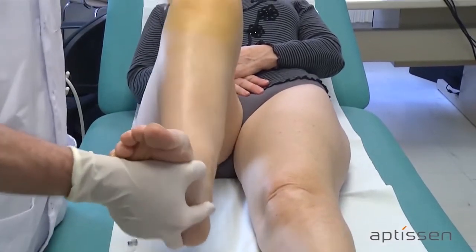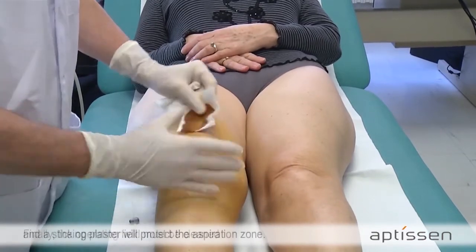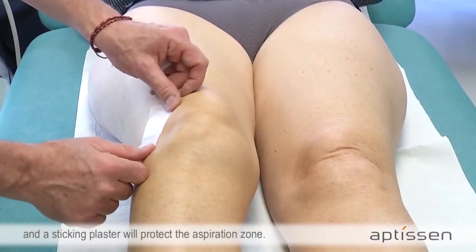Finally, the operating field must be cleaned and a sticking plaster will protect the aspiration zone.